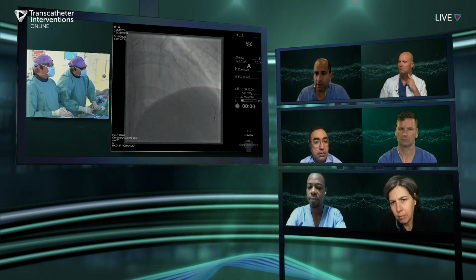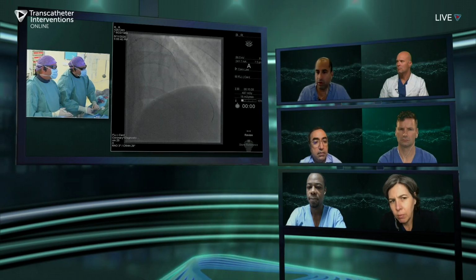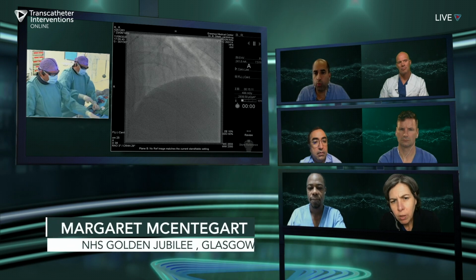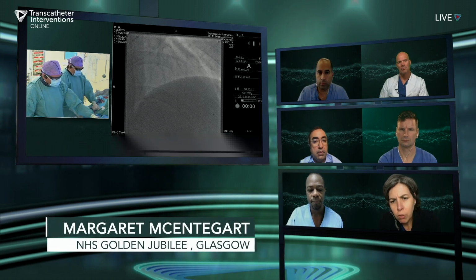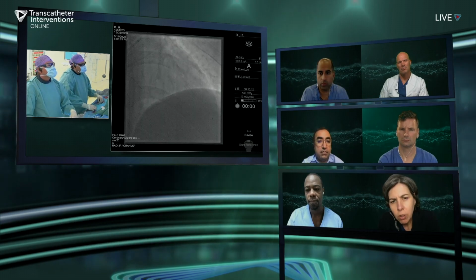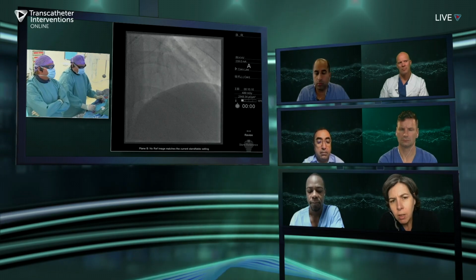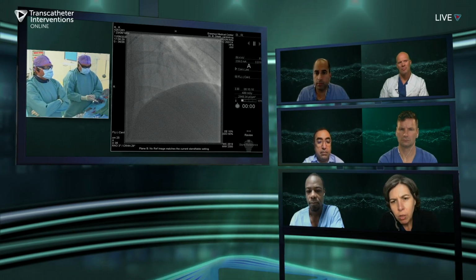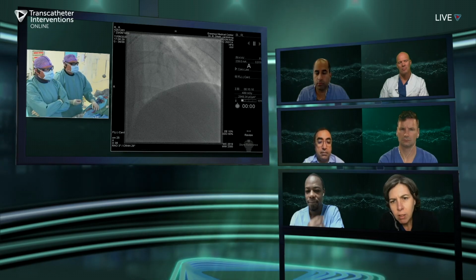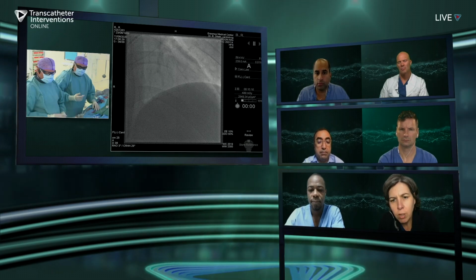Margaret, tell us a little bit about how you assessed the case from the beginning and the question I had asked you earlier. Yeah, so I would go through all the features Didier and I both discussed in our talk, just assess all the anatomical characteristics. I agree that it looks here like we've got a dominant epicardial collateral from the LAD round to the PD. And often in that situation, you don't have crossable septals coexisting. But I would do exactly as the guys did here. I would explore the septals because it's a safer option, because sometimes you have non-visible connections.